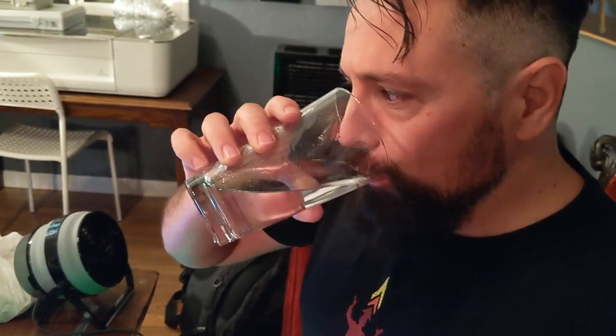Let's do it. Alright, guys. Down the hatch. Drink, drink, drink, drink. That definitely went down.